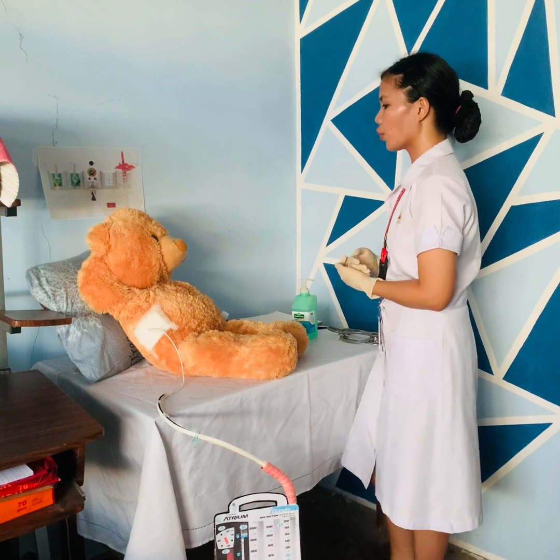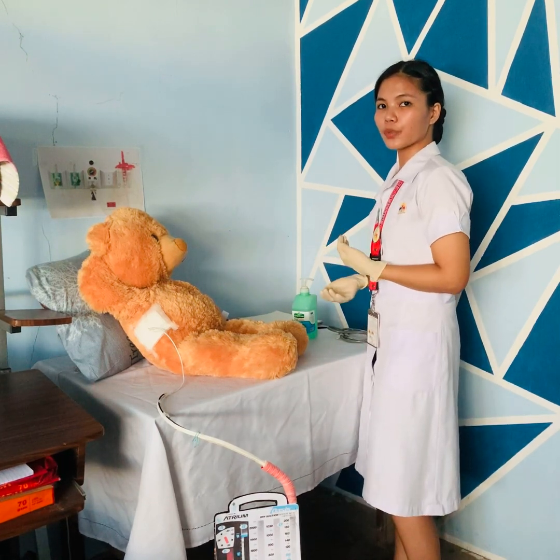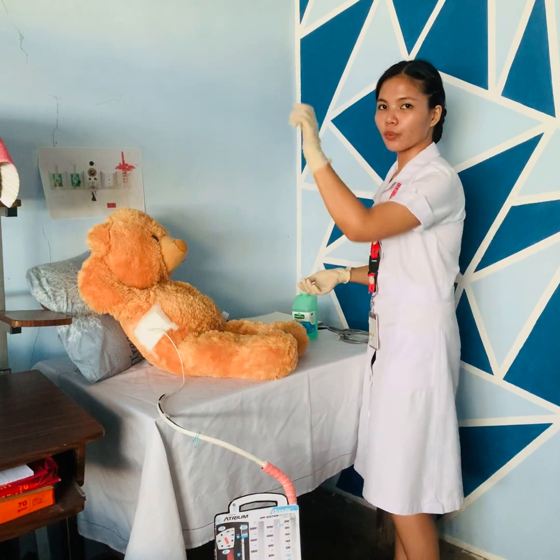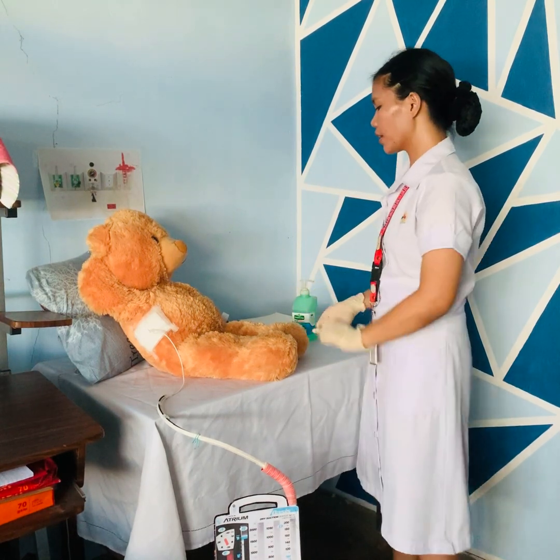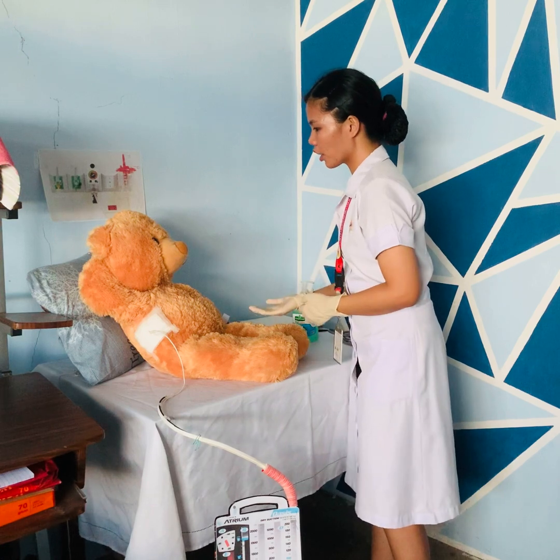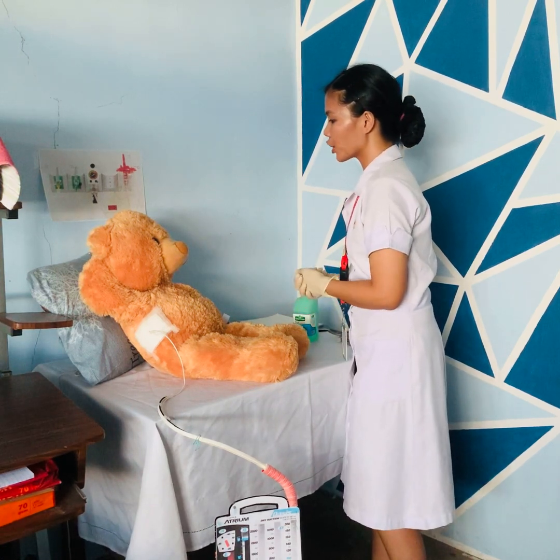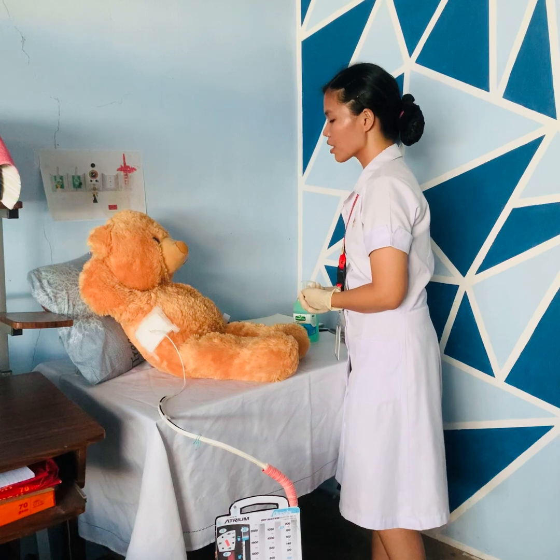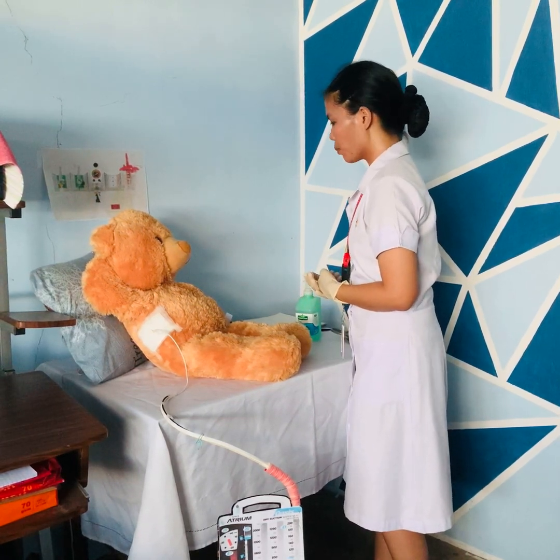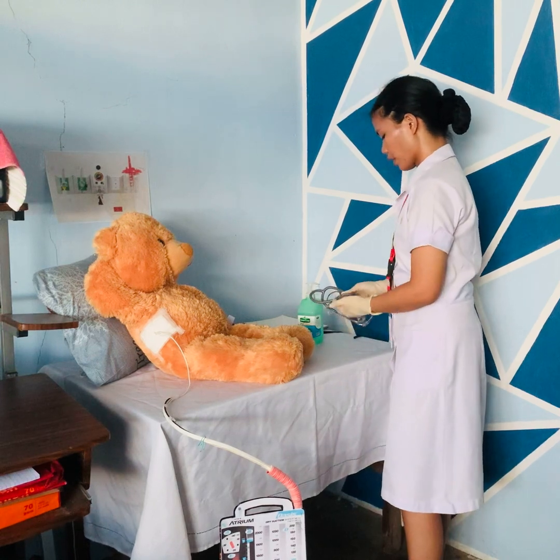After explaining, we need to provide privacy by closing the door or drawing curtains. Then, relax lang po kayo and I will do an assessment of your respiratory status to determine if your condition is stable.